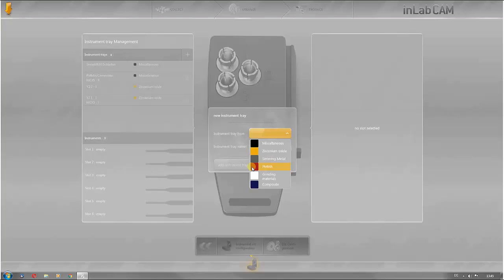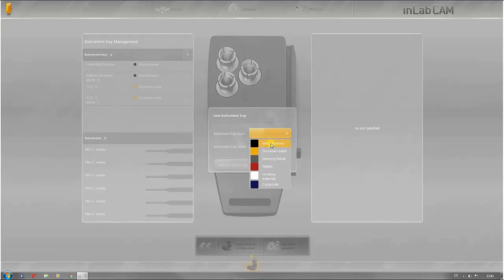Grey for sintering metal, red for PMMA, white for grinding materials and blue for composites. In this example, the material zirconium oxide is selected and the instrument tray designated.